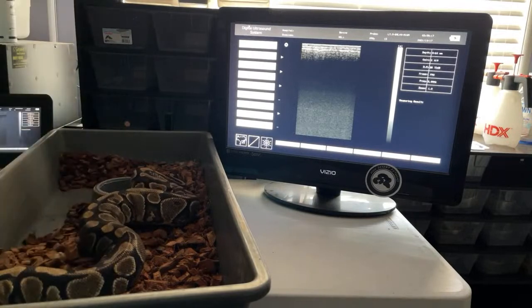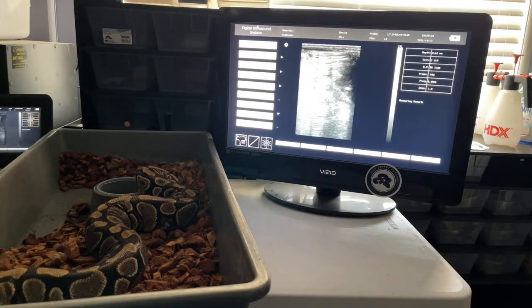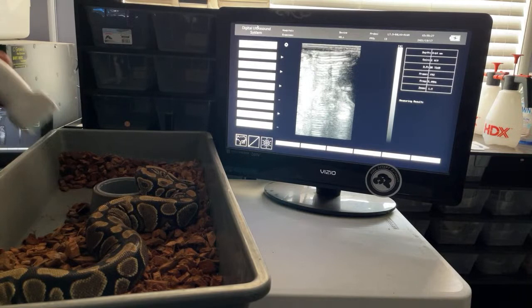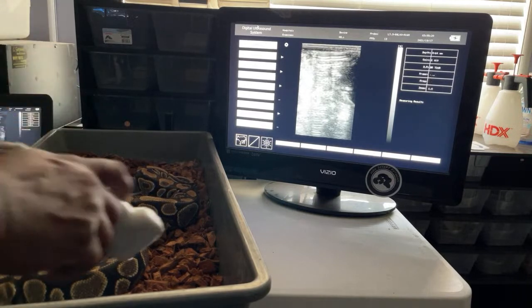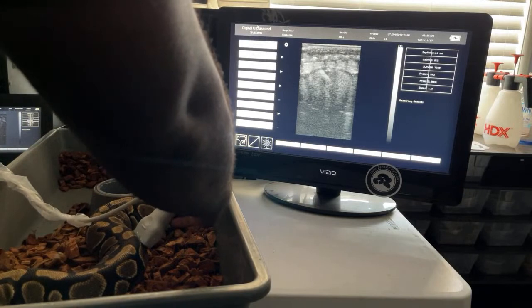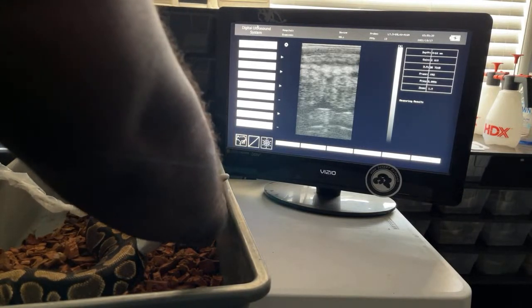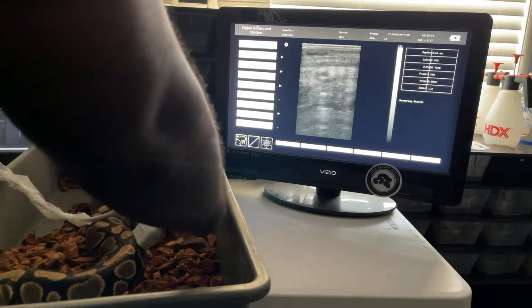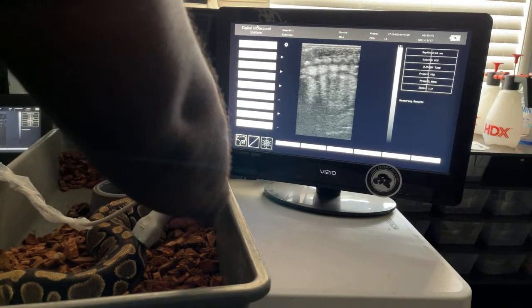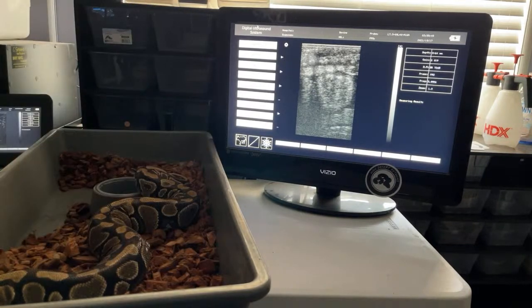I haven't checked her in a long time. She paired a few times and she took last year off. Hopefully this will be the year I get female freeways or female entry freeways, because I can't seem to hit females. And those are some big follicles. Right off the rip, right there. Let's go back. Freeze. Nice.